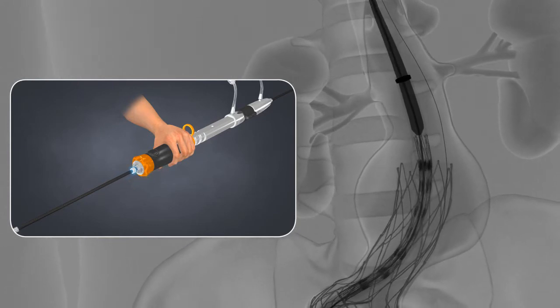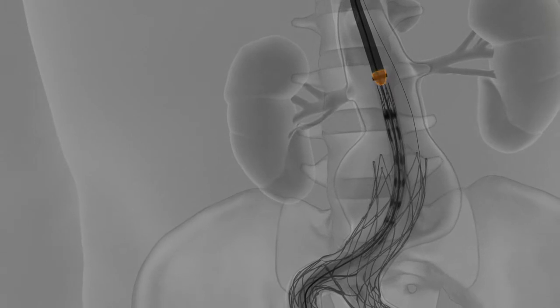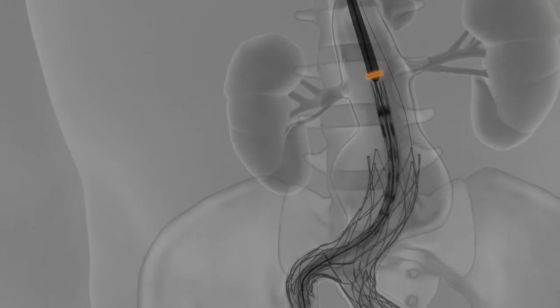Continue to advance the inner core until you hear it click. The base of the radiopaque tip is now aligned with the RO marker band of the introducer sheath.